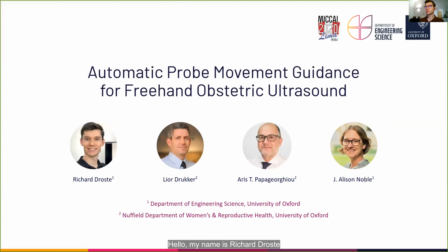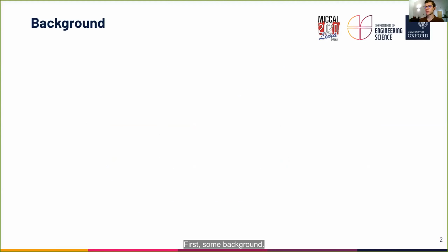Hello, my name is Richard Droste, and I will be presenting our paper, Automatic Probe Movement Guidance for Freehand Obstetric Ultrasound. First, some background. Ultrasound scanning is an indispensable tool in obstetrics, since it is safe, real-time, and low-cost, and it aids in the early detection of fetal abnormalities.